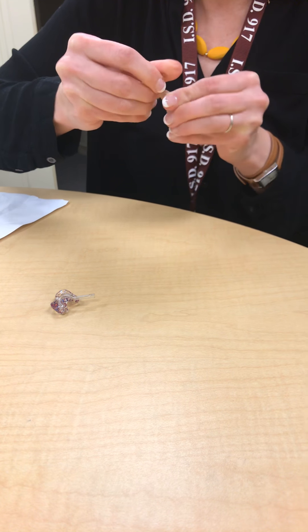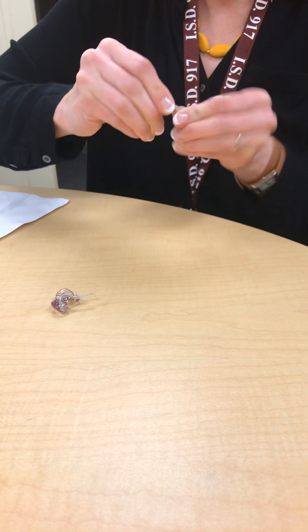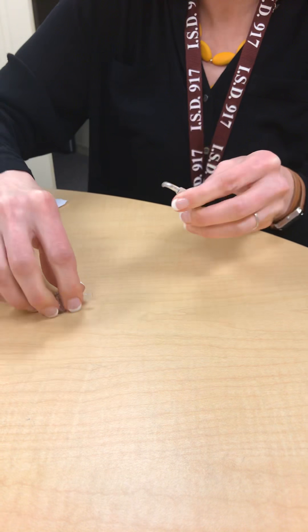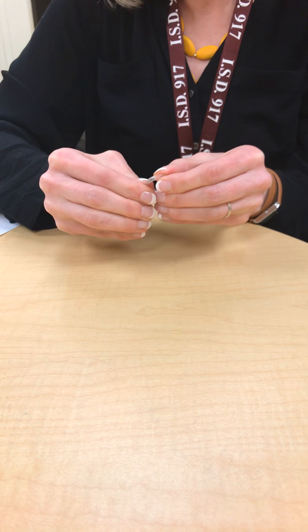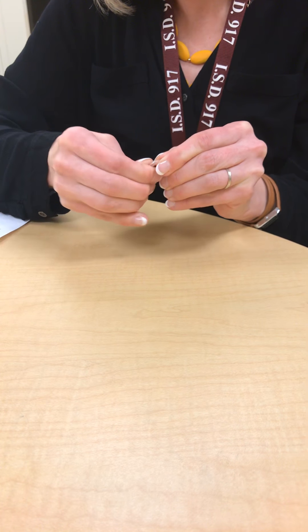If none of this resolves the issue, the ear hook also screws back on the same way — righty tighty, lefty loosey. It's a little difficult to get it started sometimes, but there it goes and it's back on.